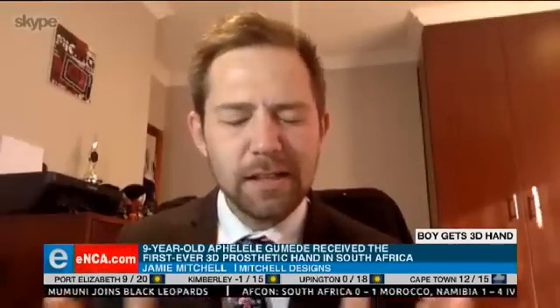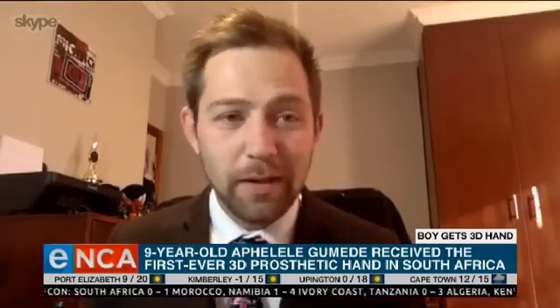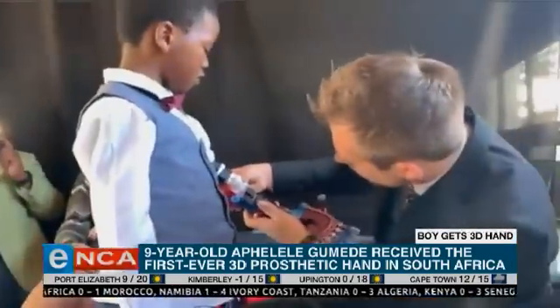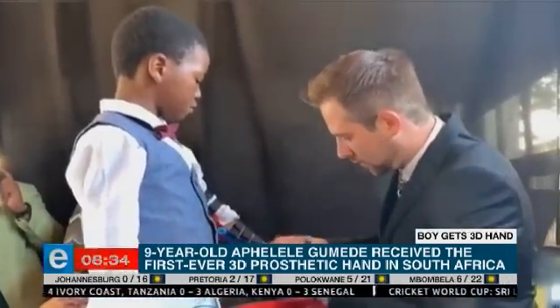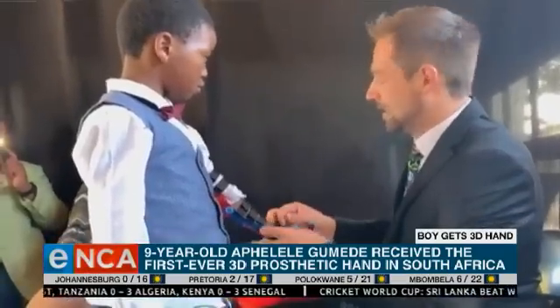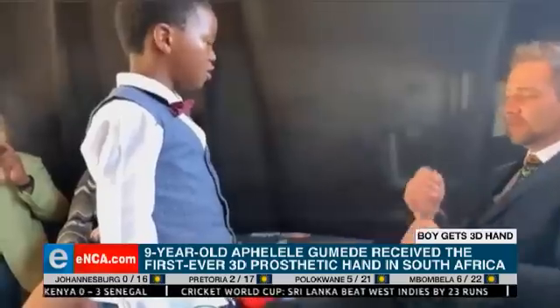It was absolutely insane. Apelele is such a cool little dude and yes, he was excited and me as well — we were going absolutely fanatic. It's the first time we actually saw that hand close with the kinetic action that it uses. It was really, really exciting. He absolutely went crazy. It was awesome.